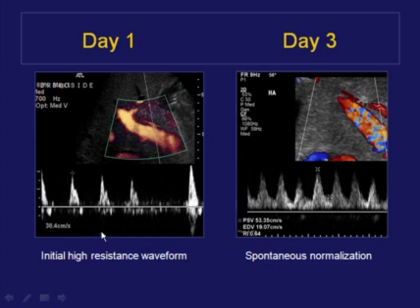So this patient on day one had a perfectly normal looking hepatic artery and power Doppler next to the portal vein, but if you notice, the waveform had lack of flow during diastole, so the resistive index is essentially 1. Nonetheless, the peak systolic velocity was still reasonably adequate. It was easy enough to find the artery, and most importantly, clinically, the patient was doing well. We followed carefully, and sure enough, by day 3, the waveforms had normalized. The resistive index was now 0.64 since there was flow during diastole.